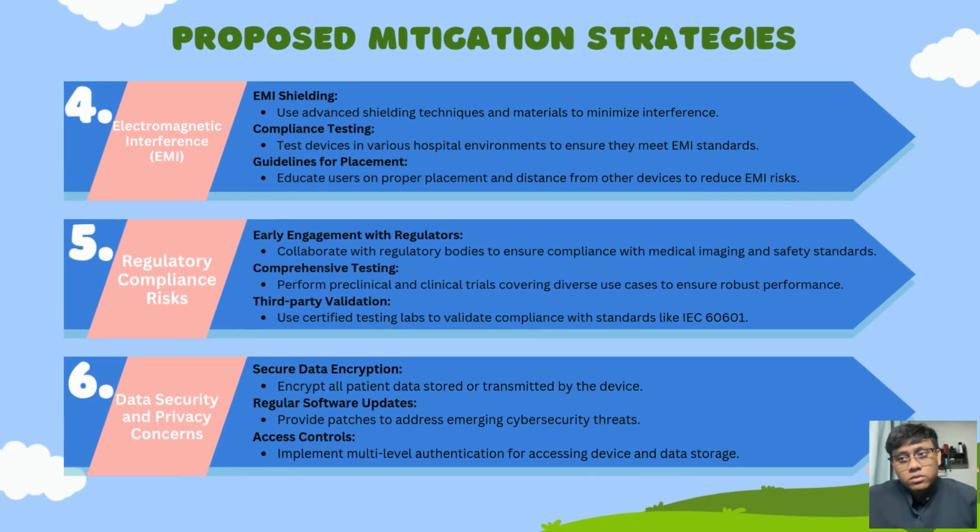Now for the fourth, electromagnetic interference, also known as EMI. For EMI shielding, use advanced shielding techniques and materials to minimize interference.